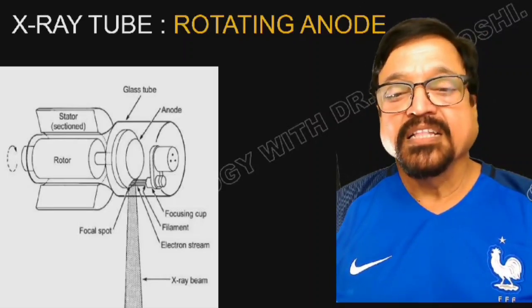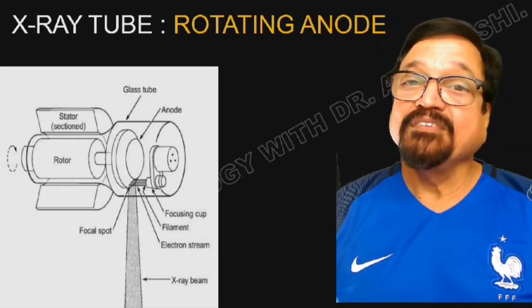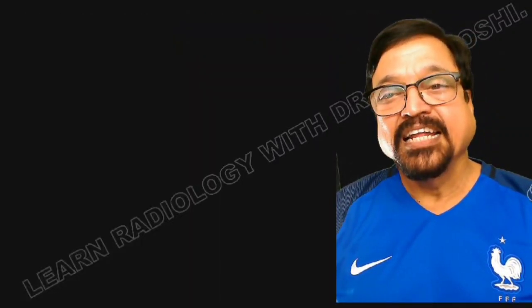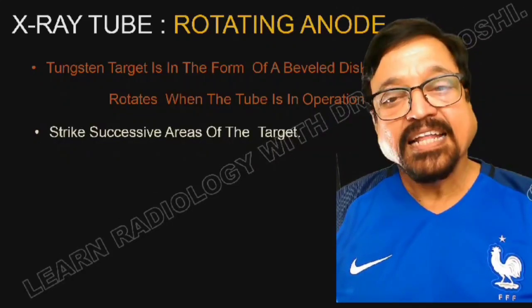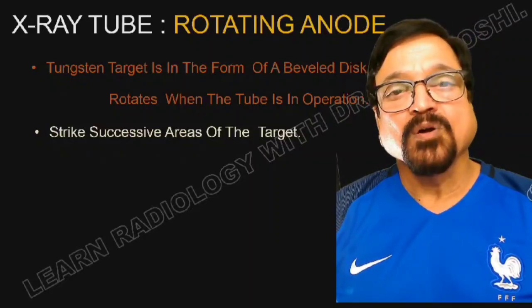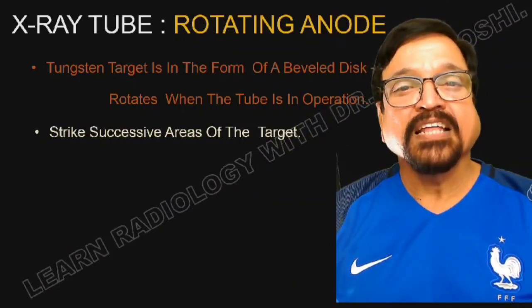Now here what is happening is the focal spot is changing because the rotor is rotating the anode. Every time a different surface comes in contact, a different area produces the X-rays. That's why the tube is more efficient. Heat dissipation is better. Here again the target is of tungsten and it is a bevel disc, because of the effective X-ray production we have seen.